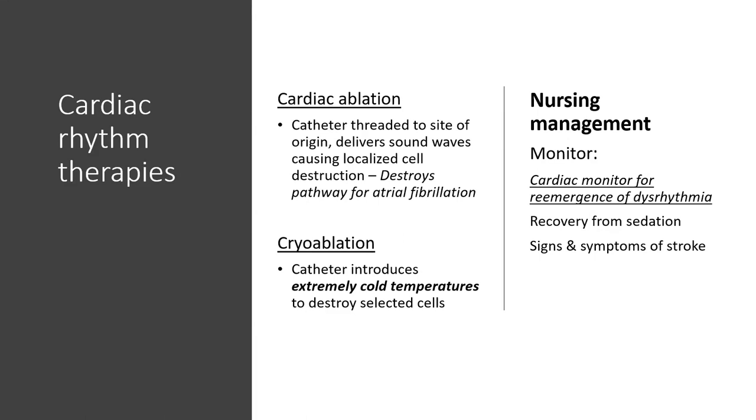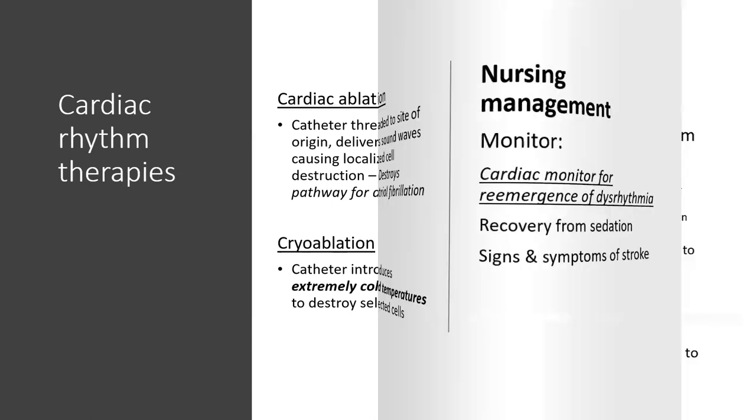And for that, we just want to use a cardiac monitor for any recurring dysrhythmias, monitor them recovering from sedation, and watch for signs and symptoms of a stroke. So with a lot of these cardiac procedures, you always want to watch for signs and symptoms of a possible stroke.